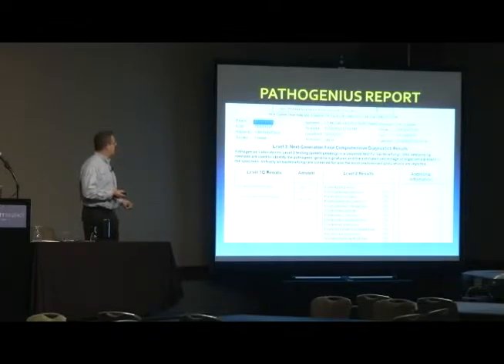Because what we have here, again, is a collaborative community of bacteria. If all of you are bacteria and this whole room is a wound bed, some of you might be attaching to host cells and blowing them up. But we're all enabling each other because we're passing genetic material amongst each other and we're all helping each other. So when you're talking about tissue and wound, you really want to take them all out.